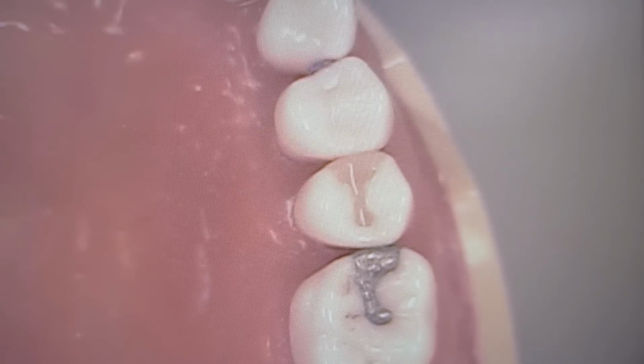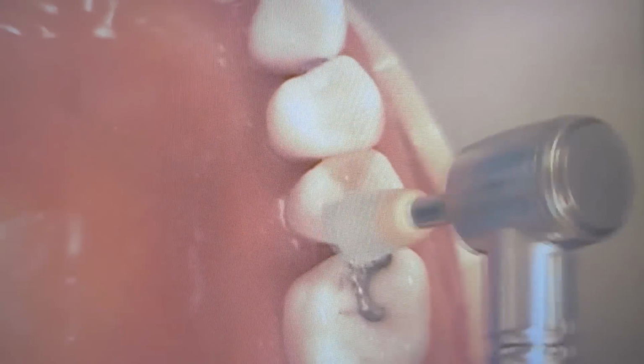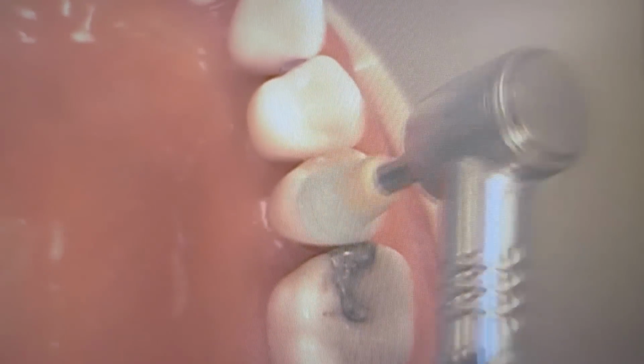Because we made sure to grab it. If you move the bur, it will go through these like water. Okay. Keep the torque converter. You should be doing it with the torque multiplier in there. You guys should. Yeah, do it with the torque multiplier. For me, it's a little bit too slow, but.